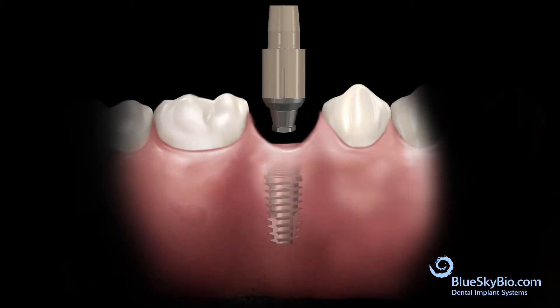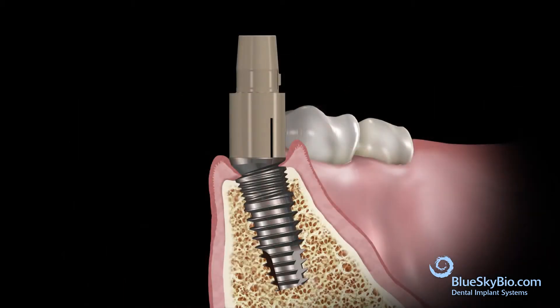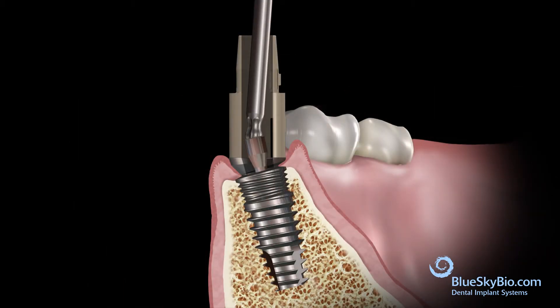Insert the assembled Rosetta components with the titanium angled base abutment into the implant and tighten the screw with the ball tip screwdriver using light finger pressure.